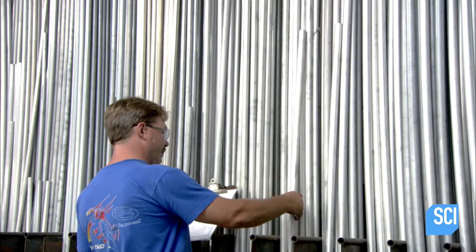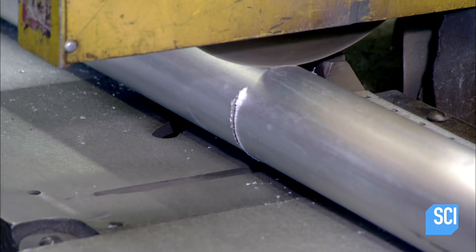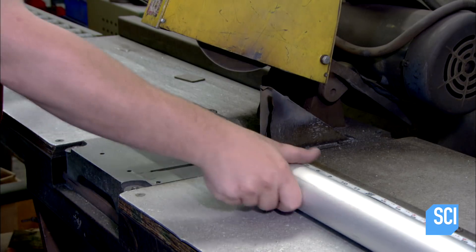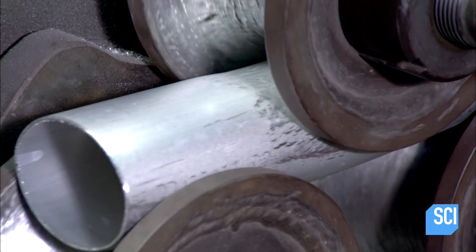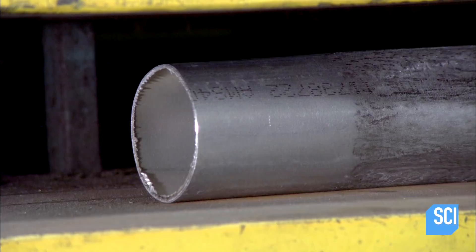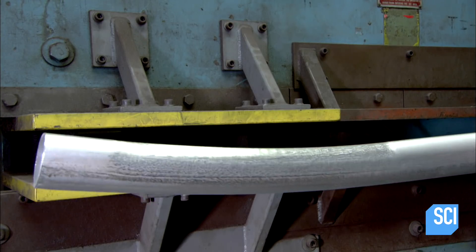The fabricator selects the appropriate aluminum tubing and cuts it to the desired length. This one will be the main tube for the racing chair's frame. Rollers curve the tube slightly at one end so the framework will accommodate the seat. A press then flattens the tube quite a bit, which stiffens the metal and will make the racing chair frame more aerodynamic.